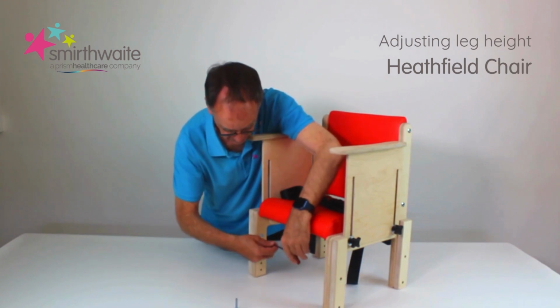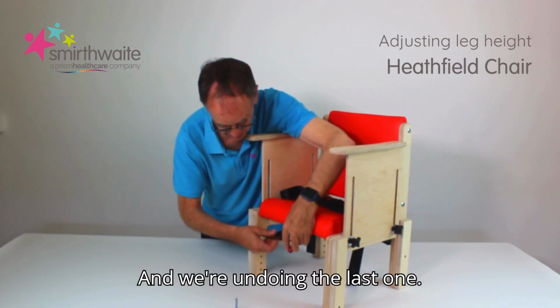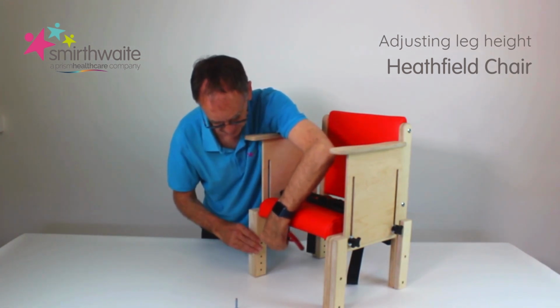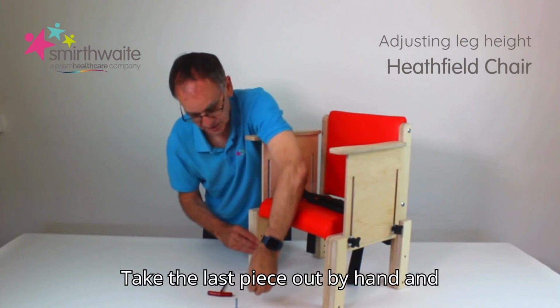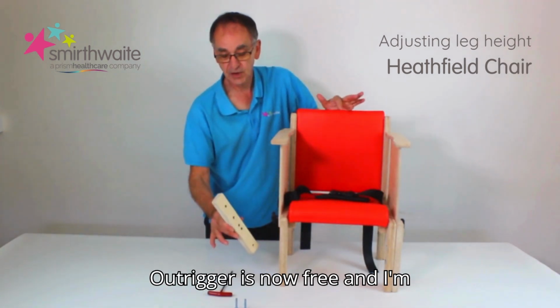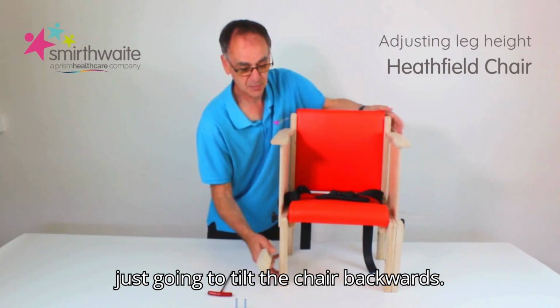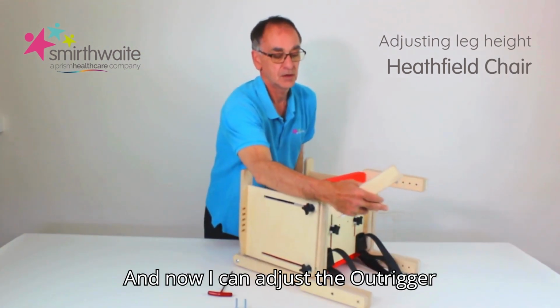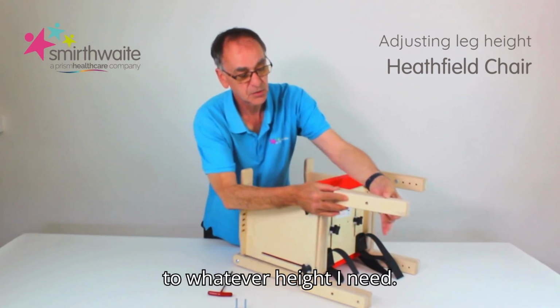There's one. And we're undoing the last one. Just going to take the last piece out by hand. And now, what we call the outrigger is now free. And I'm just going to tilt the chair backwards. And now I can adjust the outrigger to whatever height I need.